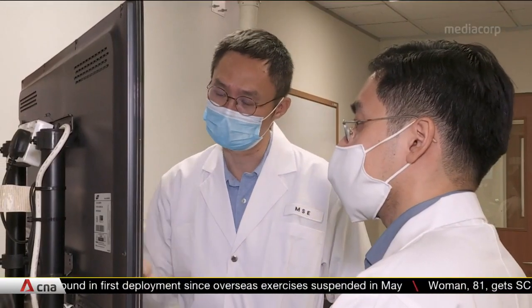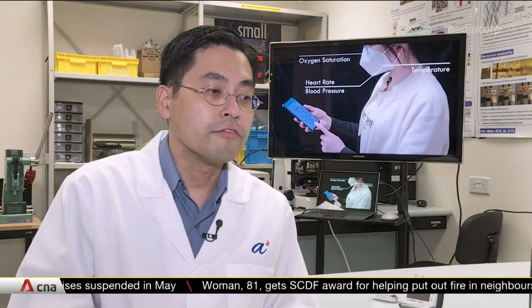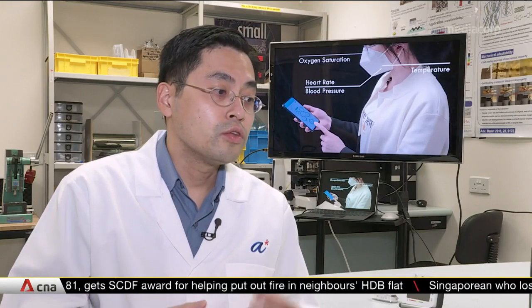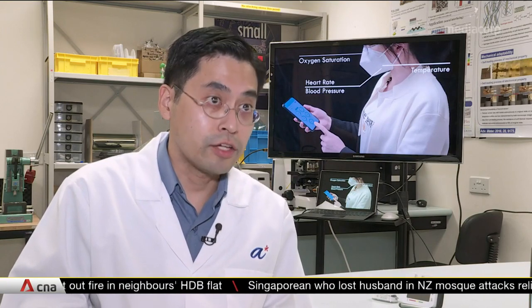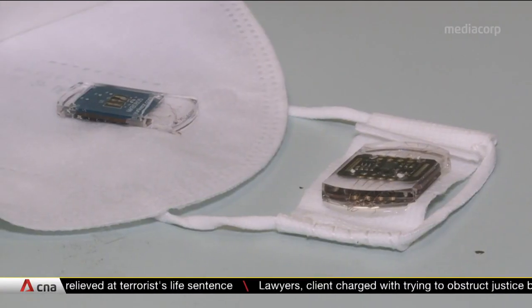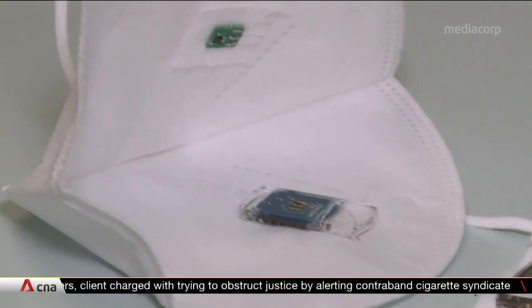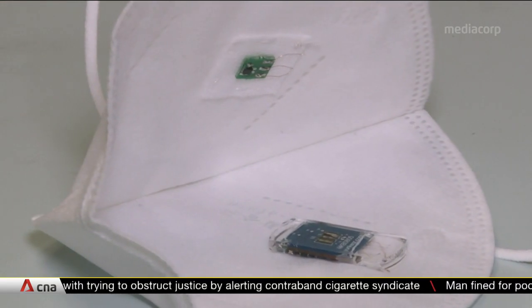The team intends to start clinical trials to fine-tune the product. A lot depends on further clinical trials and studies to ensure that the data is robust and accurate, and to make sure that wearing these kinds of masks does not damage the integrity of the sensors. Once all these factors are clear, they are more confident of rolling it out at a commercial scale.